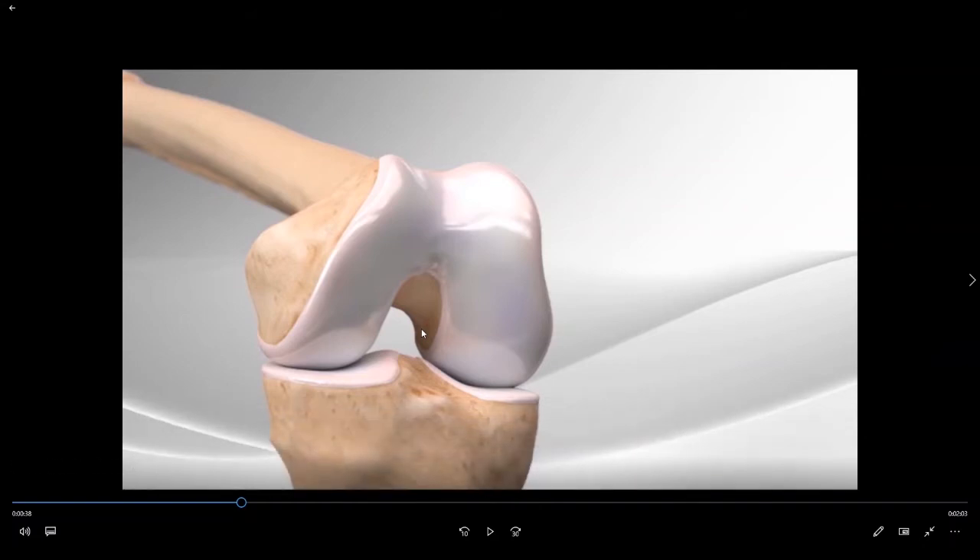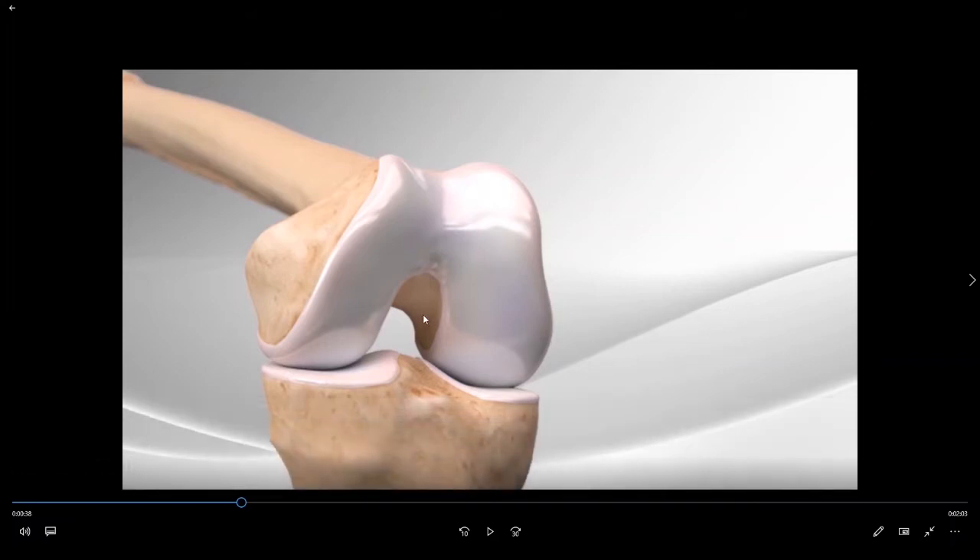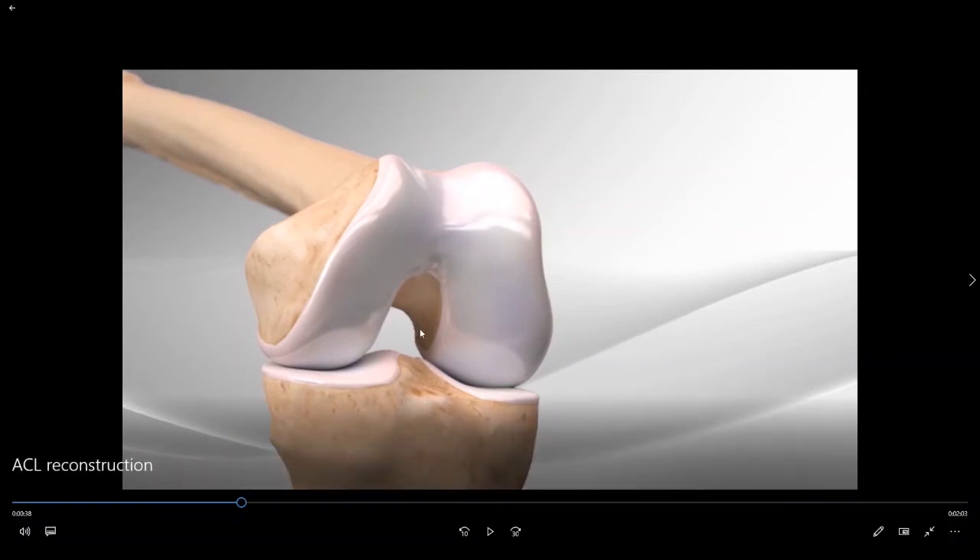We are now going to begin drilling the sockets in order to place the ACL into position. I perform an all-inside ACL reconstruction, which means that we do not drill a tunnel all the way from the outside of the bone to the inside. We simply drill a blind-ended socket which starts on the inside part of the bone and extends up into the interior of the bone using a pin.